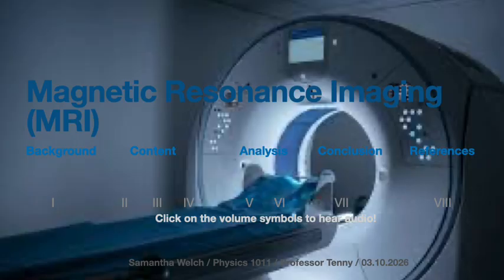One of the reasons that MRI is so valuable is that it does not use any ionizing radiation. Ionizing radiation is used in X-rays and CT scans. However, an MRI uses strong magnetic fields and radio waves to produce images.